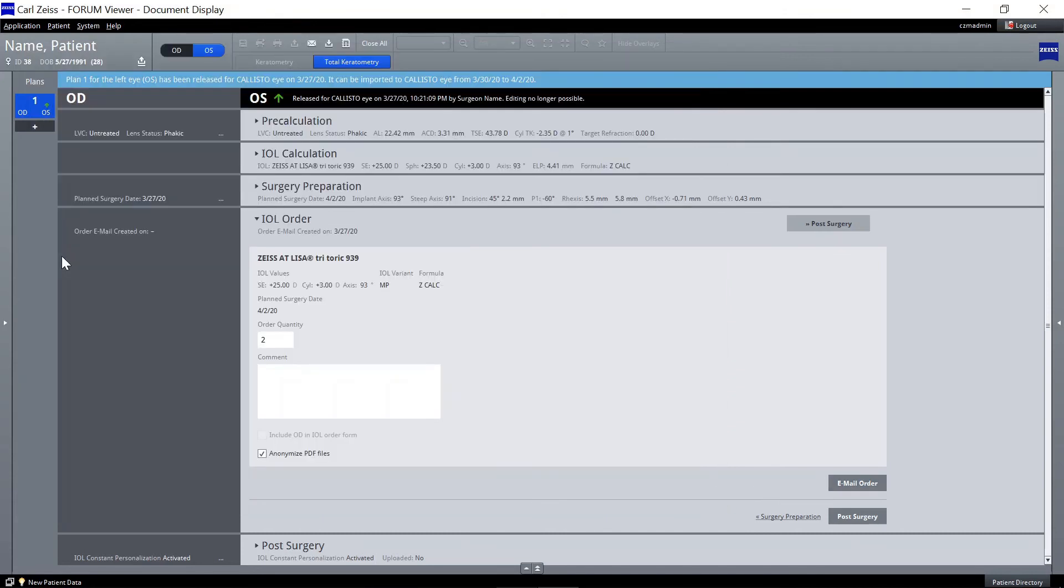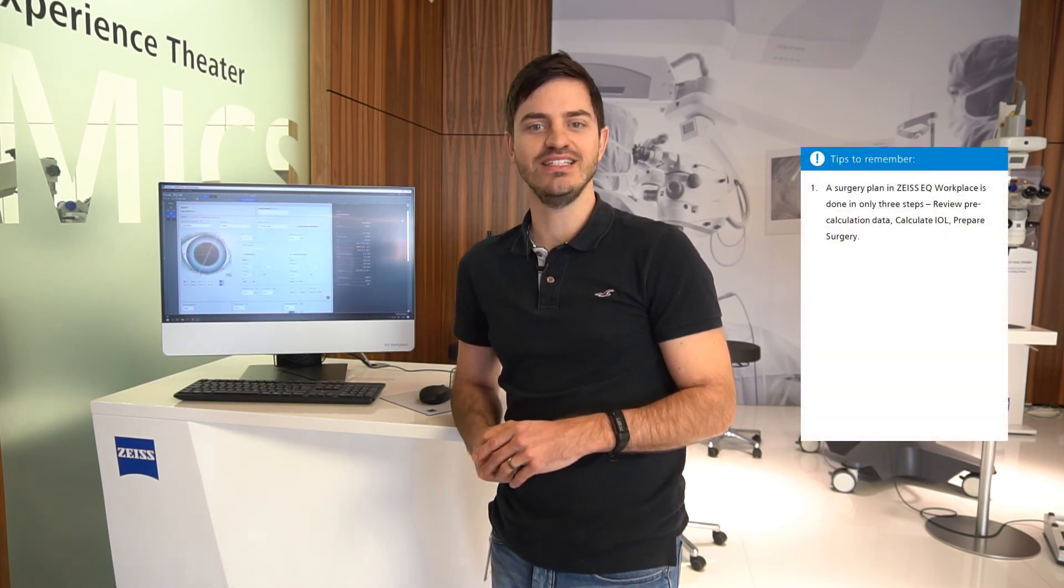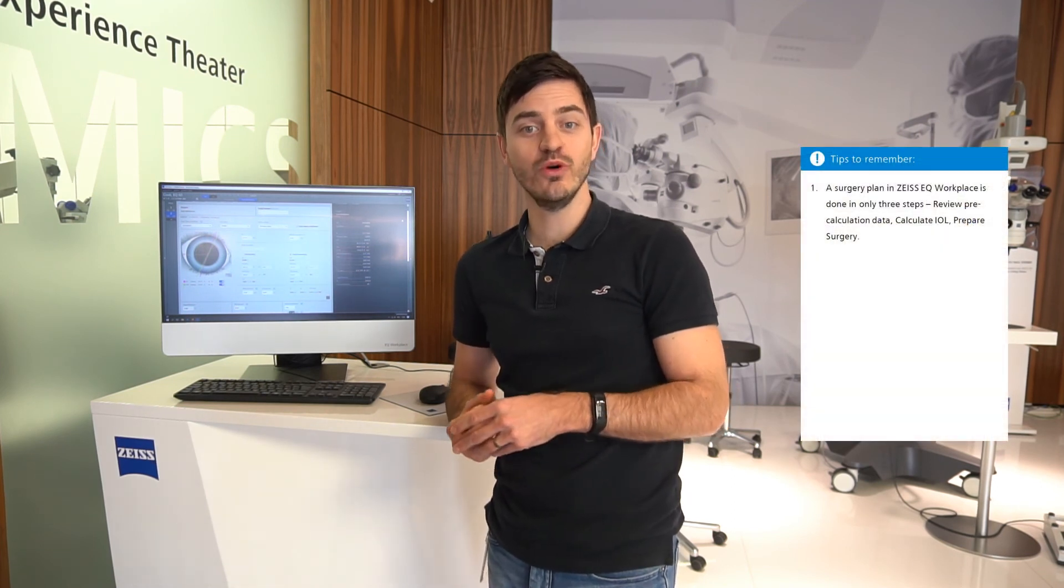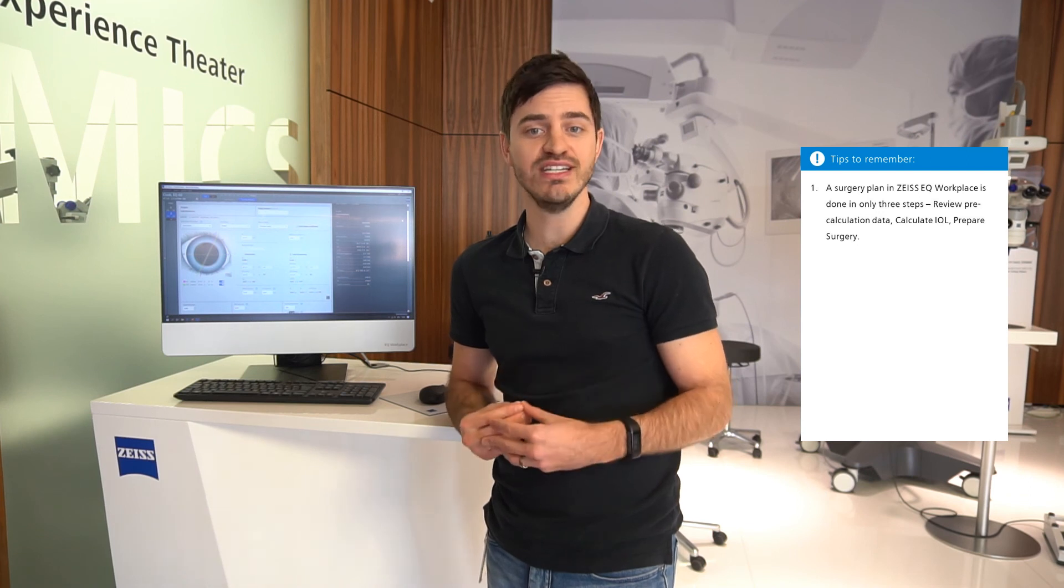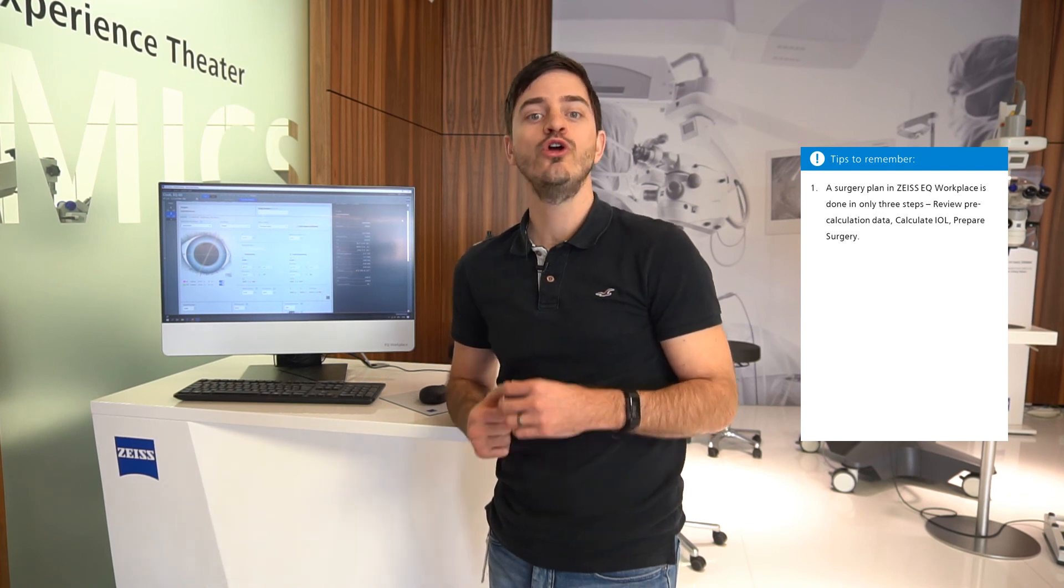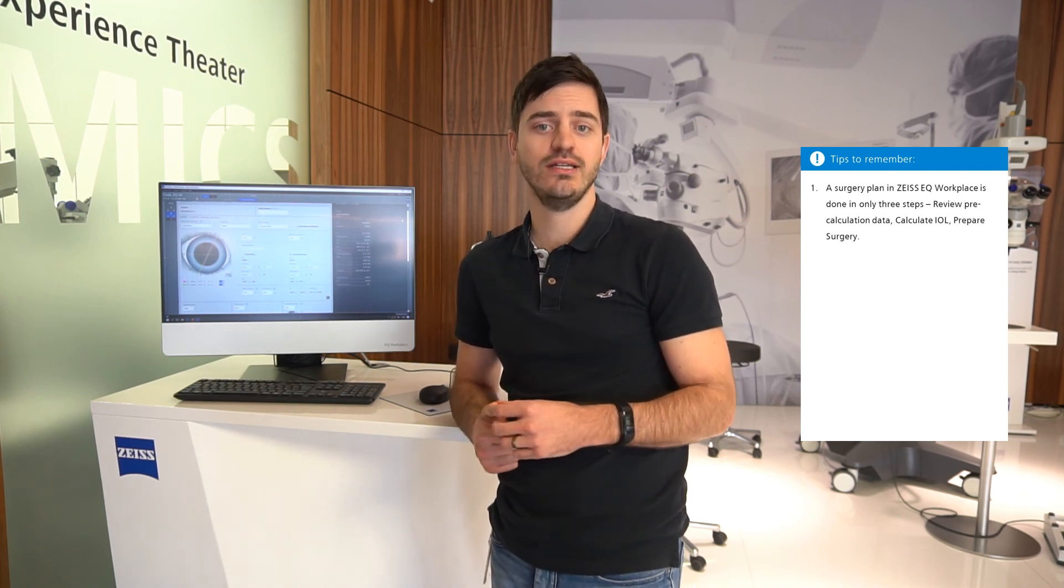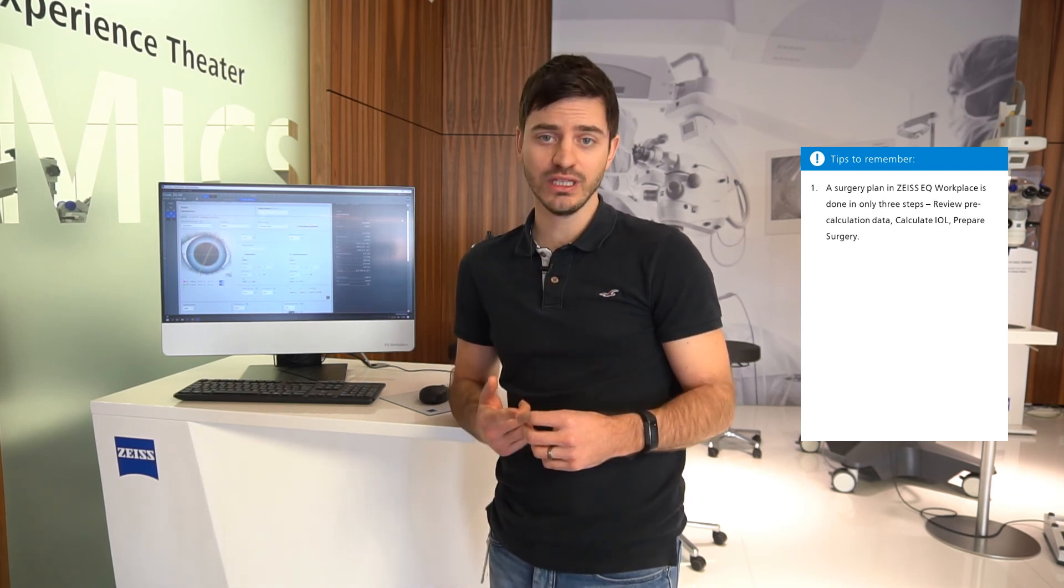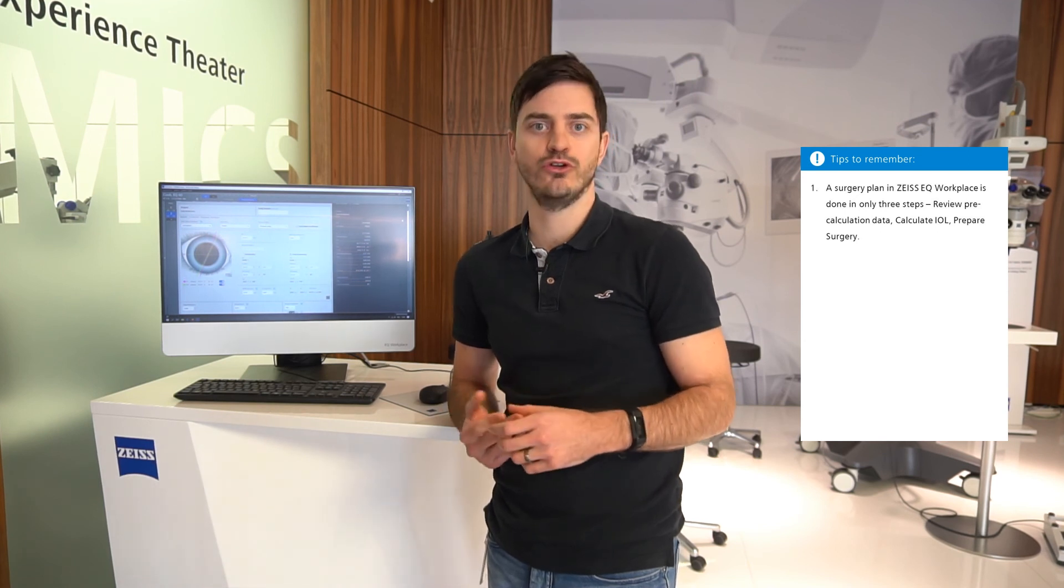That's all for this video. Here are the four tips to remember. 1. A surgery plan in Zeiss EQ Workplace is done in only three steps: Review pre-calculation data, calculate IOL, prepare surgery.